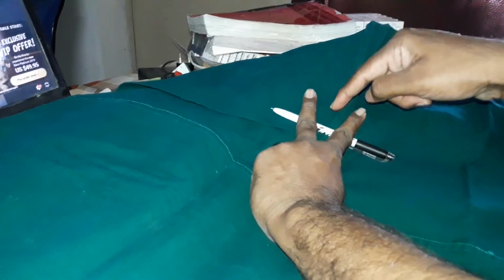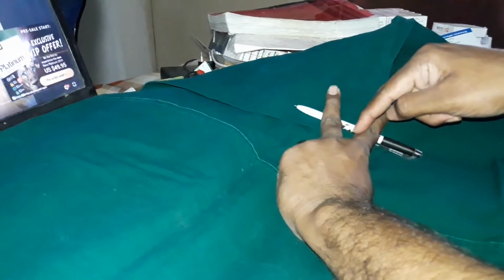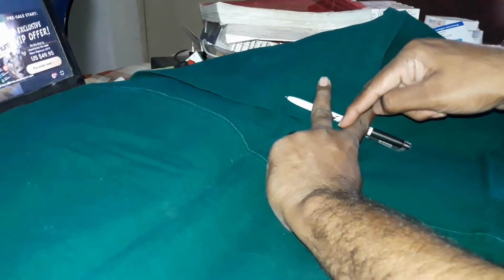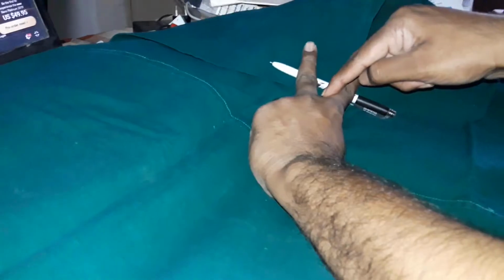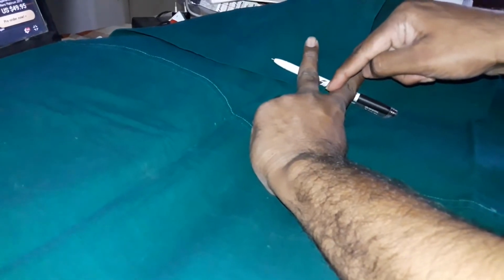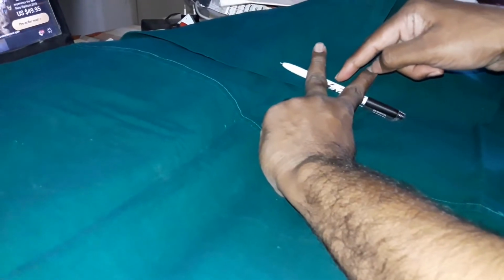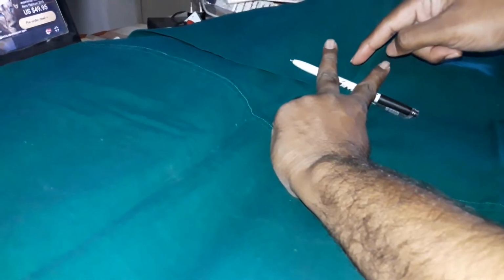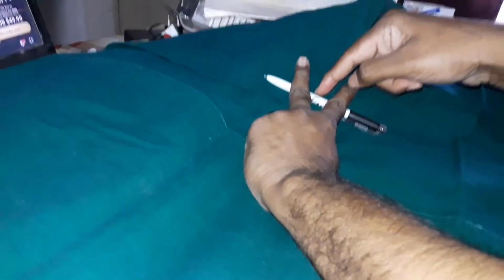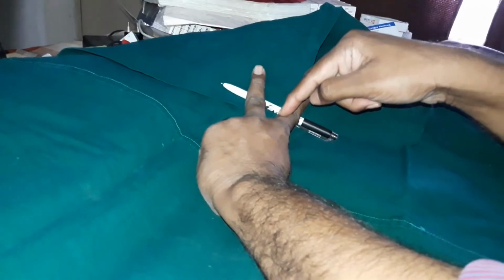Next, when you are drilling here, when you are coming below, that means at the caudal end, the space is reduced. So this point is the potential area of facial nerve injury. Your burr or your burr shaft may injure this part of the facial nerve. When you are doing cochlear implant surgery, trying to appreciate the round window, you are more focused on identifying the round window.